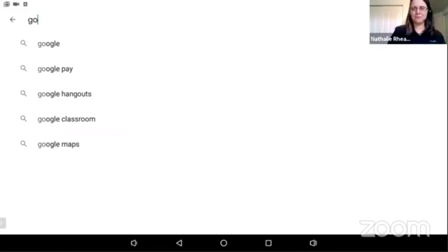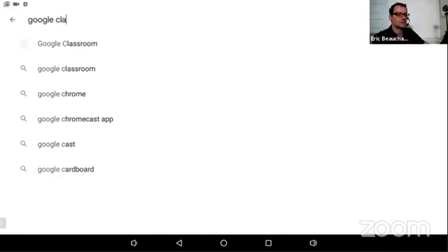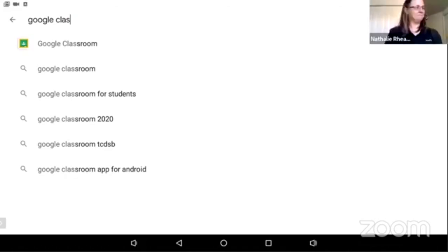Oh, it's because you typed on my Bluetooth keyboard. Yeah, that's why I typed. You have your Bluetooth keyboard on there. And at the same time, you can show what it looks like. It's a nice keyboard that we sell on the HumanWare website. Yeah, it's very light, very nice.